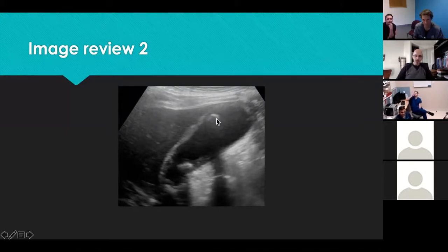Yeah. The important thing that I didn't mention is that when you are measuring the gallbladder wall, we measure it where it is perpendicular to the ultrasound beam. For example, there, if you can see the wall properly. In this specific one, you cannot see the gallbladder wall properly there.